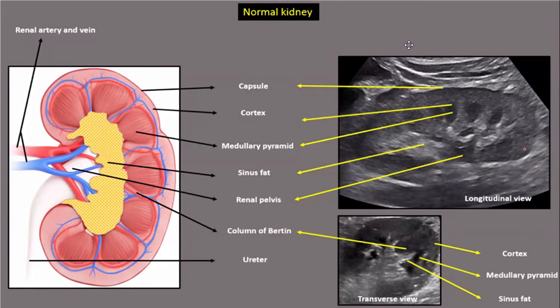Dr. Alcover, are you still there? Hello, Dr. Alcover? Yes, hello, Doc. Kindly tell us, all of us doctors, the structures that you can see here on the medulla. I can see the medullary pyramid, the renal column of Bertin. I see the cortex. So this one is the cortex. This is the renal column of Bertin. This is the medullary pyramid, di ba?